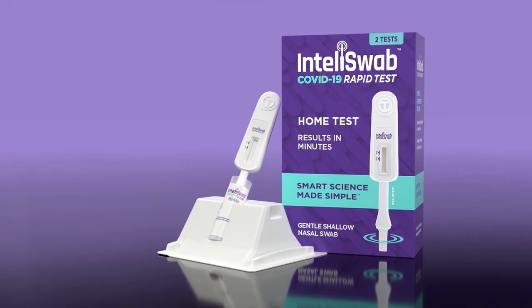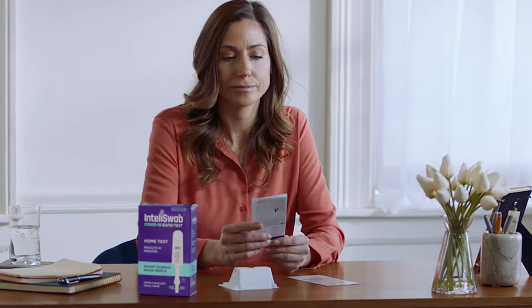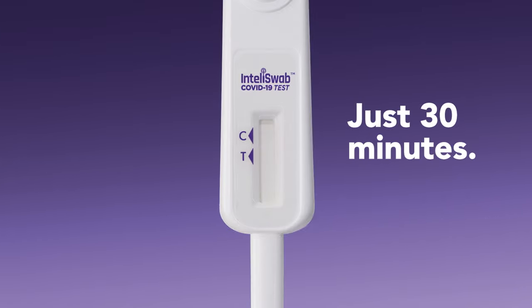The IntelliSwab COVID-19 Rapid Test is designed to be the most intuitive and easy-to-use self-test available. It's so simple and user-friendly, it can be used anywhere and anytime, providing easy-to-read results in just 30 minutes.